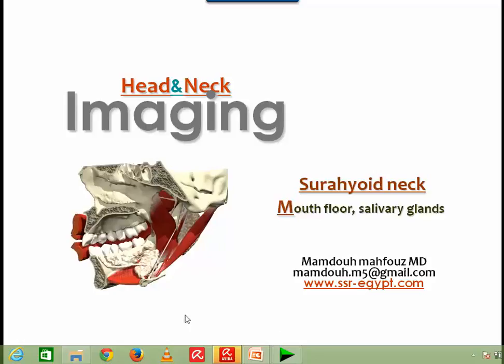Dear colleagues, now we are going to discuss an important issue, which is the imaging of the neck proper. And you know that the neck is generally divided from the imaging point of view into the suprahyoid neck, the structures above the level of the hyoid bone, and the infrahyoid neck. In the suprahyoid neck, we usually deal with the imaging of the floor of the mouth as well as the salivary glands.